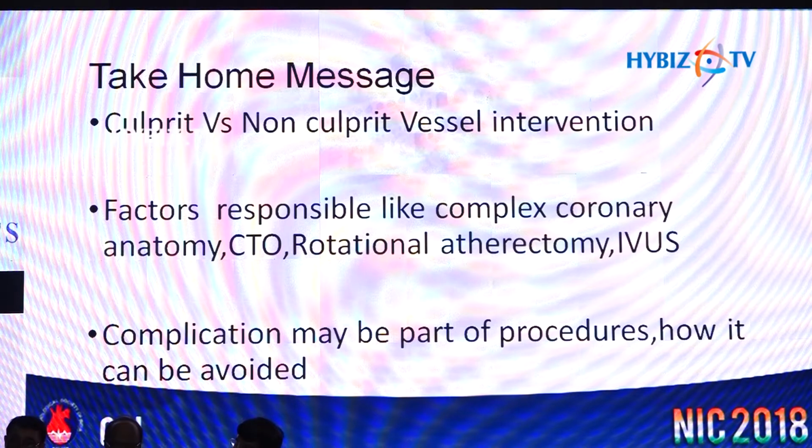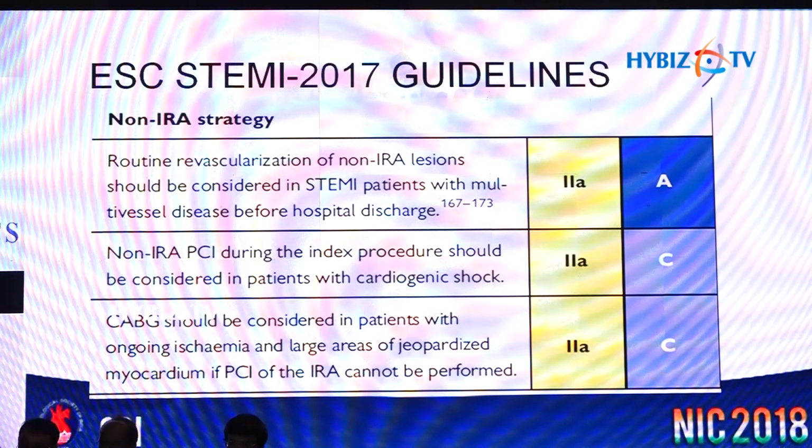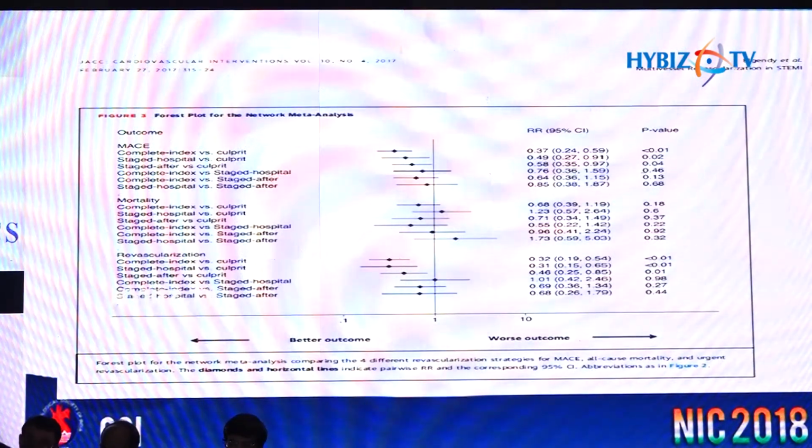So we have to find out what was the cause of perforation. You managed it well. So you think it's oversizing, Dr. Raman? Yes, sir. We have to see that again. It was definitely oversized. In my experience, when you have a new inflation device, you suddenly go up. When the old one is used, it goes slowly. So probably it must have gone up suddenly.